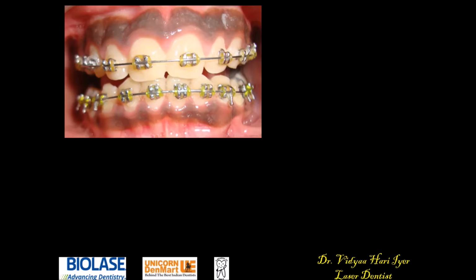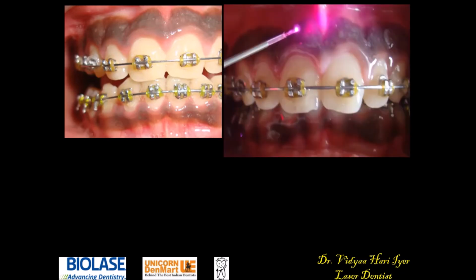Now, this melanin, as we call it, which is a pigment here, when seen in excess, when a patient smiles, they don't like that melanin to be shown. And today, with a lot of social media and people wanting to look good, smile good, taking very close pictures of themselves, these are a concern. So this patient had black chocolatey gums, and all we did was a procedure called depigmentation. So the pigment was there, and depigmentation means removal of the pigment.